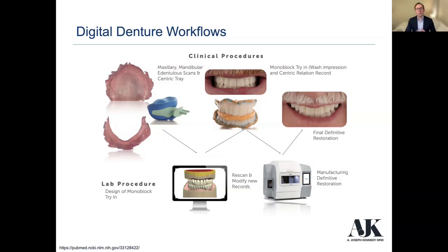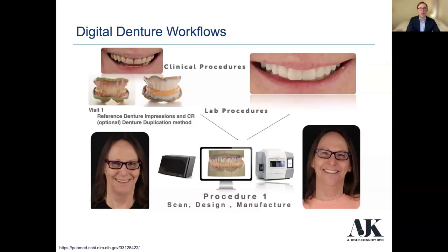And you can see we do a lot of removable in the clinic that I work at in a residency program. It's really nice to take what was once 5 or 6 visits to get a denture from start to finish down to 3 or 4. Definitely saves you on the chair time. Patients are pretty impressed with the way that things work here. So it's just a nice addition to the workflow and certainly expedites the treatment time.